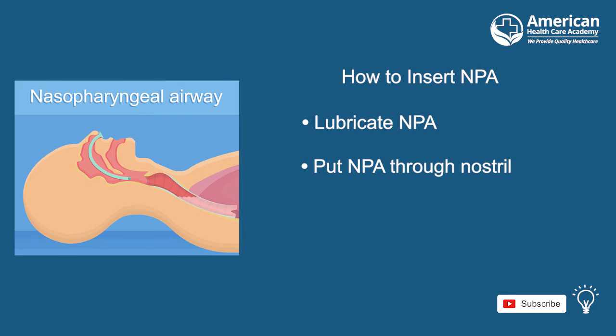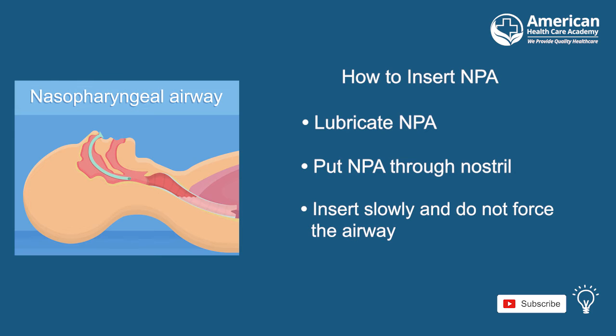Put the airway through the nostrils slowly, moving in a backwards direction down toward the floor of the nasopharynx rather than upwards. Be careful when inserting the airway, as it can irritate the mucosa or lacerate the tissue, and do not force the device.